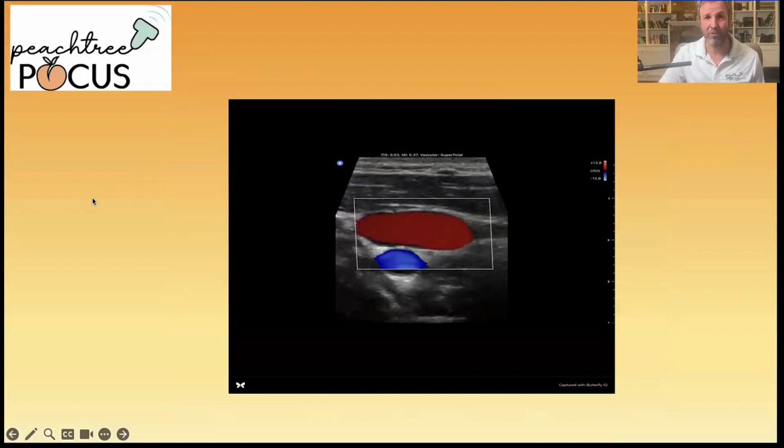All right. On screen, you'll see the carotid artery beneath the internal jugular. And here's a pearl just to quickly mention. Don't get fooled by the color. Red versus blue doesn't tell you artery versus vein. It just shows the direction of flow relative to the probe.